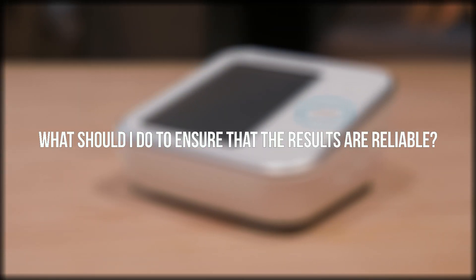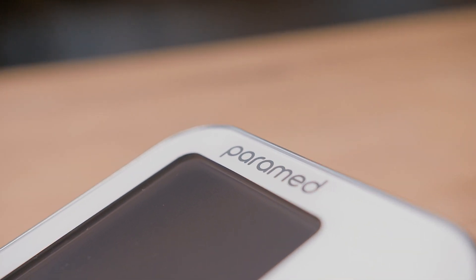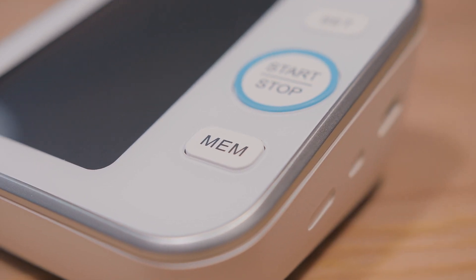What should I do to ensure that the results are reliable? We advise sitting still for at least 10 minutes before starting measurements, then follow the procedure instructions carefully.